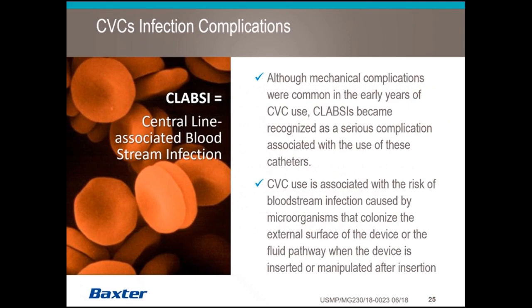One potential complication that can occur with CRRT therapy are CLABSIs, central line associated bloodstream infections. As most of you know, a CLABSI is a primary bloodstream infection that develops in a patient with a central line when it's not related to infection at another site. CLABSIs, of course, affect your hospital's reimbursement and other factors, and so hospitals are very stringent in making sure that nurses follow the proper procedures in caring for patients' central lines.